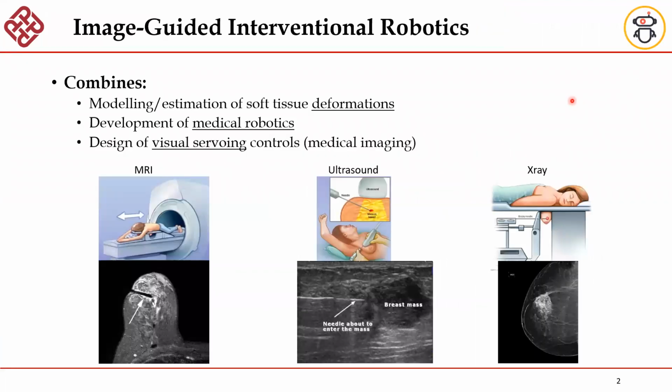This work is part of what we call robotic systems for medical interventions, specifically for biopsy. In this type of application, we generally want to introduce a biopsy needle into some tissues. We have been working on breast biopsy for some time.